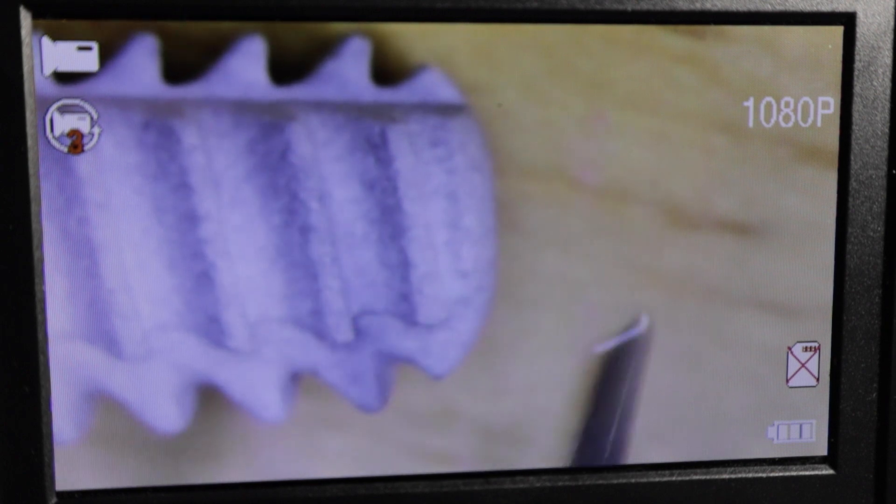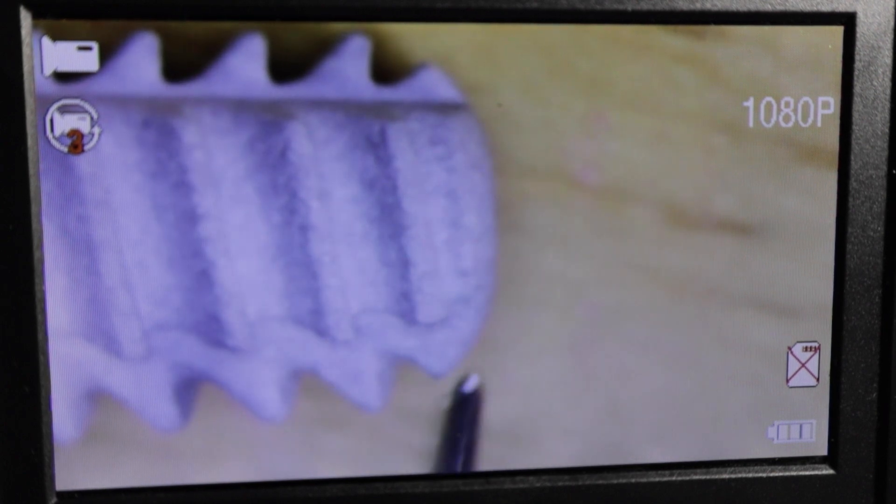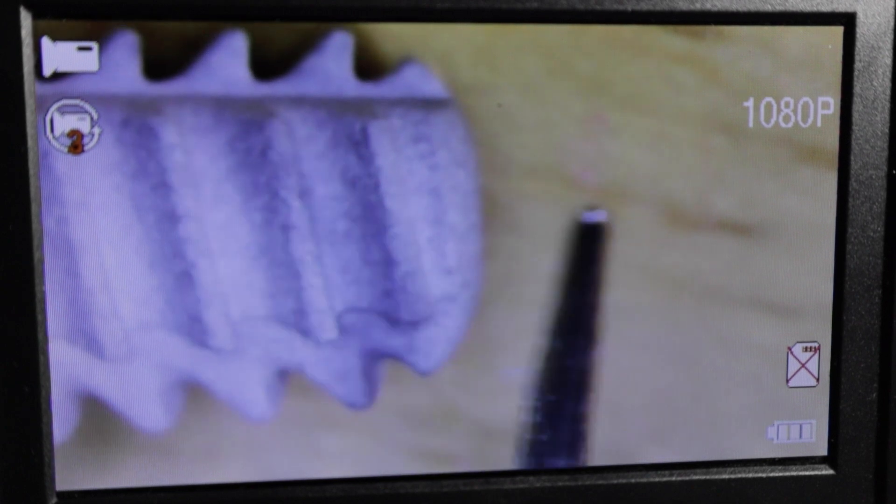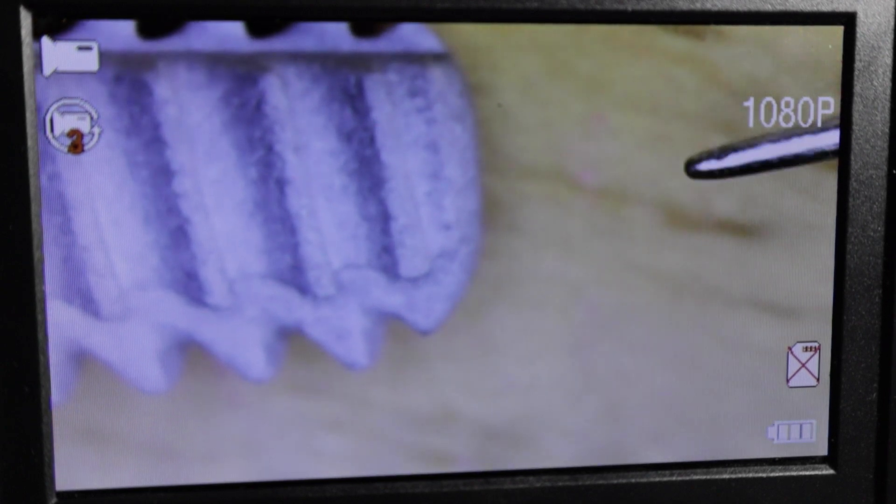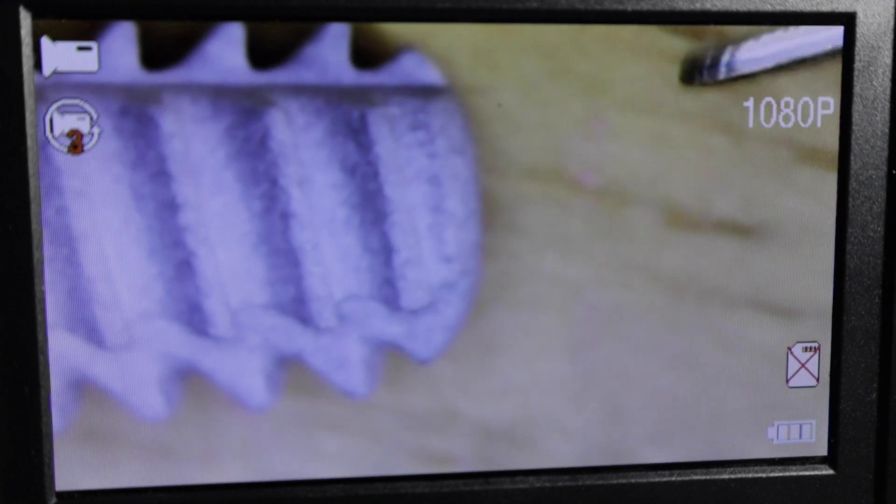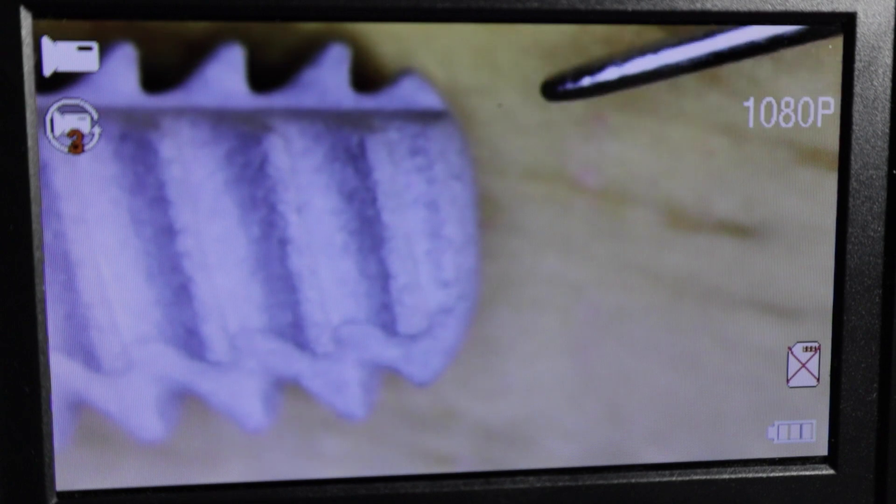Now here at the apex you see that this apex is round. So I like having a round or a flat apex, something that's not going to tear any sinus membrane that's over here. So if you have anything that's sharp around here this might potentially damage a sinus membrane.